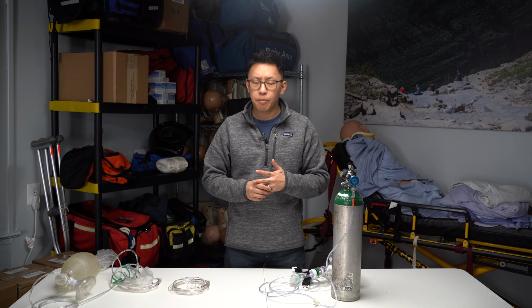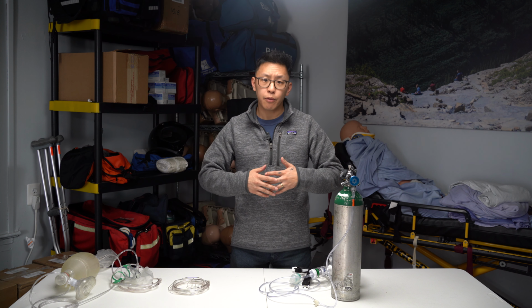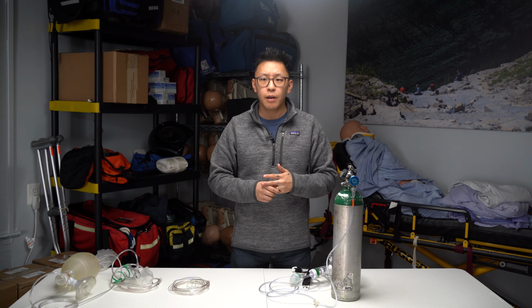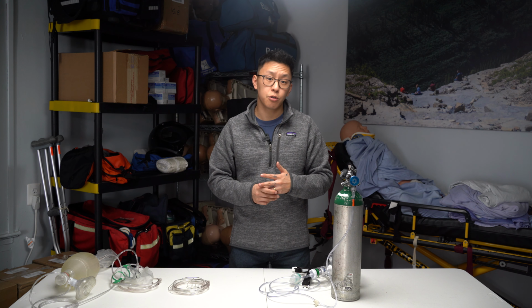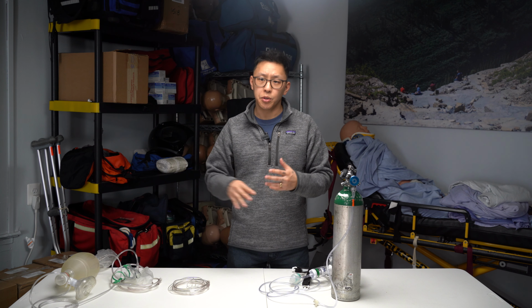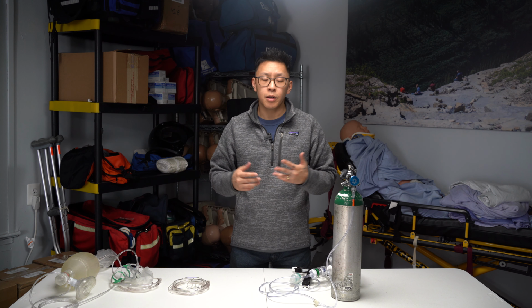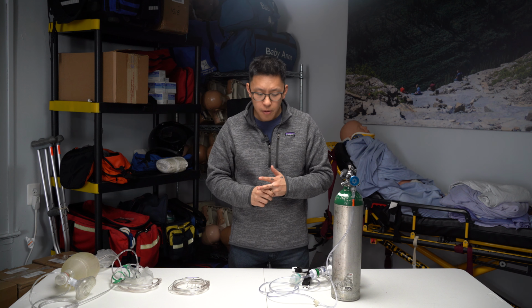Typically in most protocols, once you apply CPAP, it's written that you do not remove or stop CPAP until you transfer care, and they will have respiratory at your receiving destination to transfer care to. Especially if it's pulmonary edema, we don't want to stop that pressure, for that fluid to come back into the alveoli, and in one sense, it could feel like that patient might be drowning from the inside.